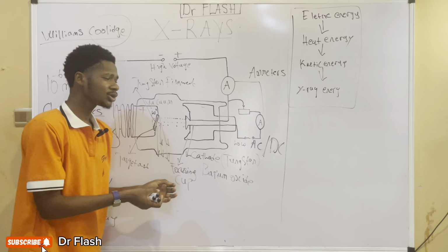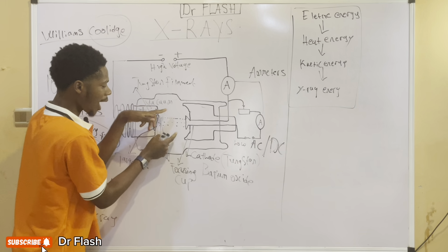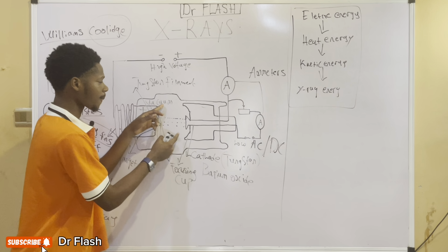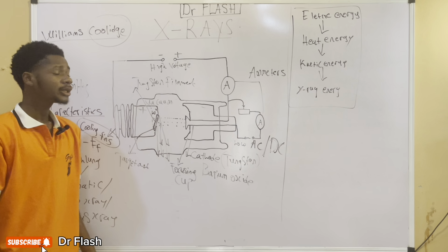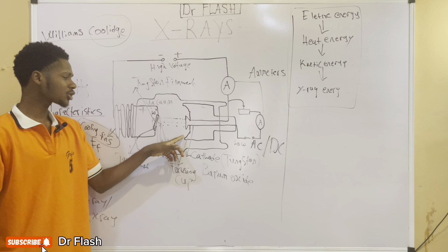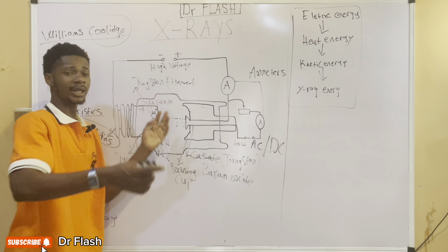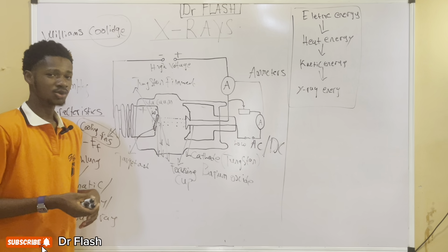The reason we do that is for X-rays that are flying in another direction. There is no way we are going to have a complete vacuum, simply because even if we remove as much air as possible from inside this tube, there will still be tiny amounts of air particles in it. So the electrons can also hit air particles, changing direction. Instead of the perpendicular direction we wanted, they go in another direction, which could actually interact with the human body and cause damage to tissue.